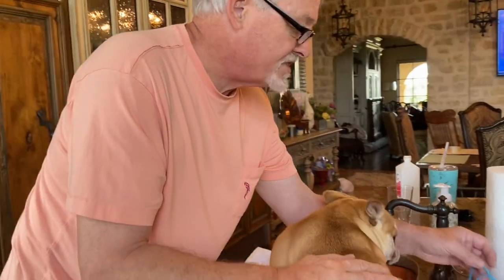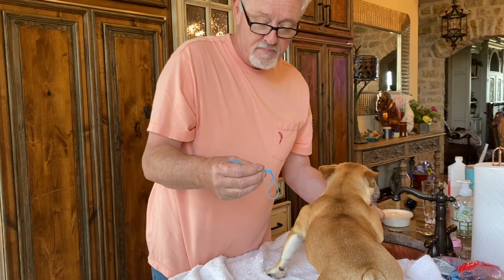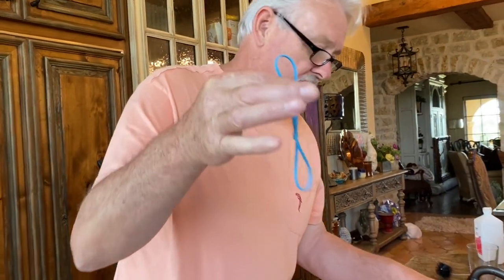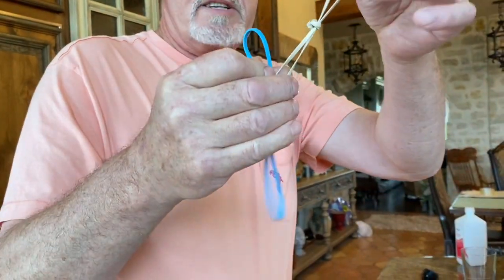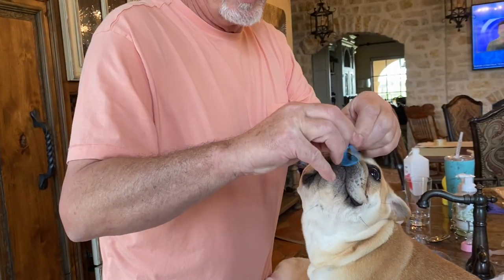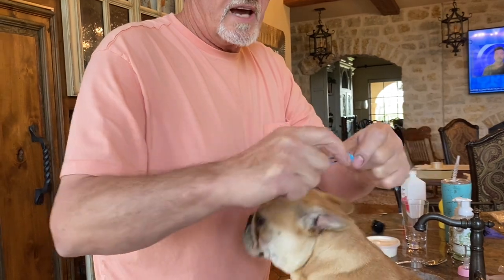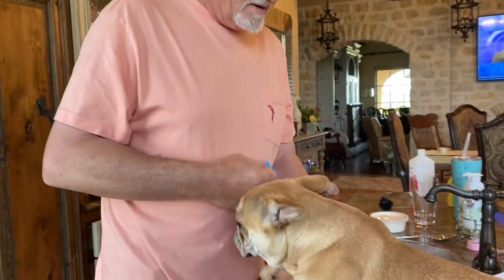So this is so easy if you know how to do it. This is my idea — I haven't seen anybody else do it. What you do is you get an elastic band and tie an entire knot in the middle of it. You can take a couple of smaller elastic bands tied together and get a nice knot in the middle. I'm going to put a bigger knot in the middle of this — it makes it a little easier. So what is the tourniquet? The idea is you want something where you can constrict the blood so that the vein pops out.